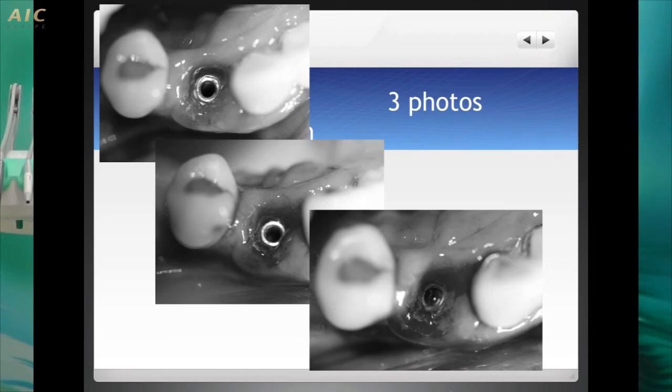And that's why when you do impressions, you go there, and then when your assistant comes with the impression material, you have already lost the impression, okay? But that's something that I want to explain another day. I do a combined technique to do that, but that's something that we are going to explain in the future.